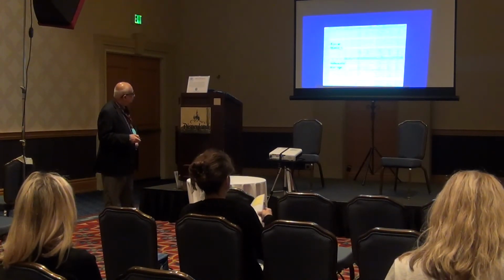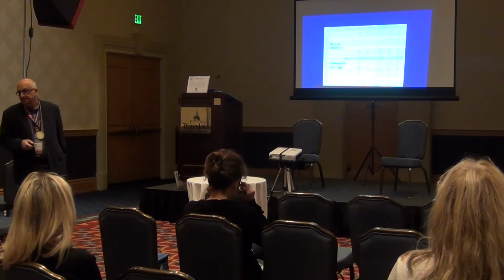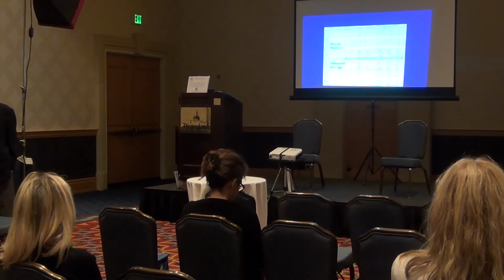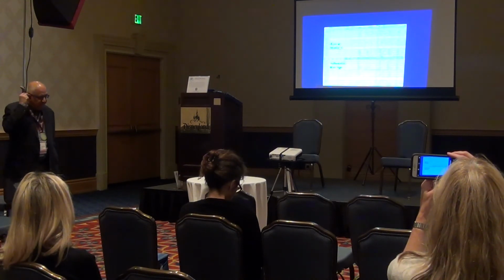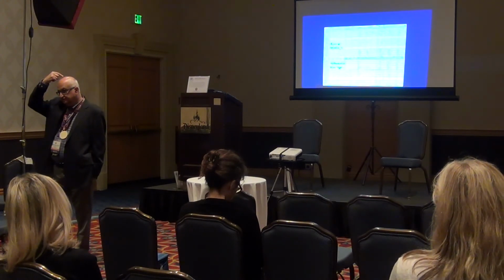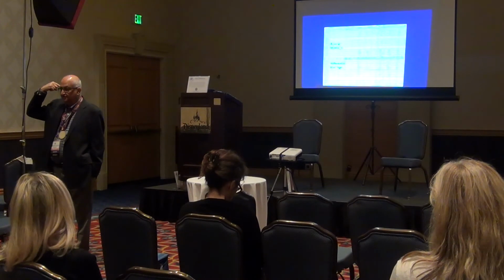Then, I mentioned to you earlier, bipolar versus referential montage. I'm not going to go into the niceties of it because it's a little technical. We try to get a sense of the dipole of the field. Because if we compare everything to the ear, and if I have a disturbance here, the amplitude will be highest here when it's compared to the ear.